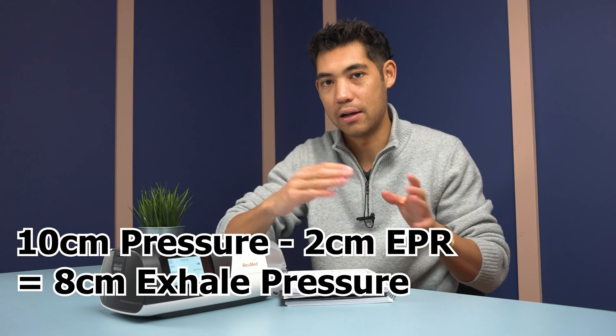The levels one, two, and three represent how many centimeters of pressure it reduces when you exhale. For example, if you have a set pressure of 10 centimeters of water pressure and EPR is set at two, then when you exhale it dips to a pressure of eight — 10 minus two equals eight.